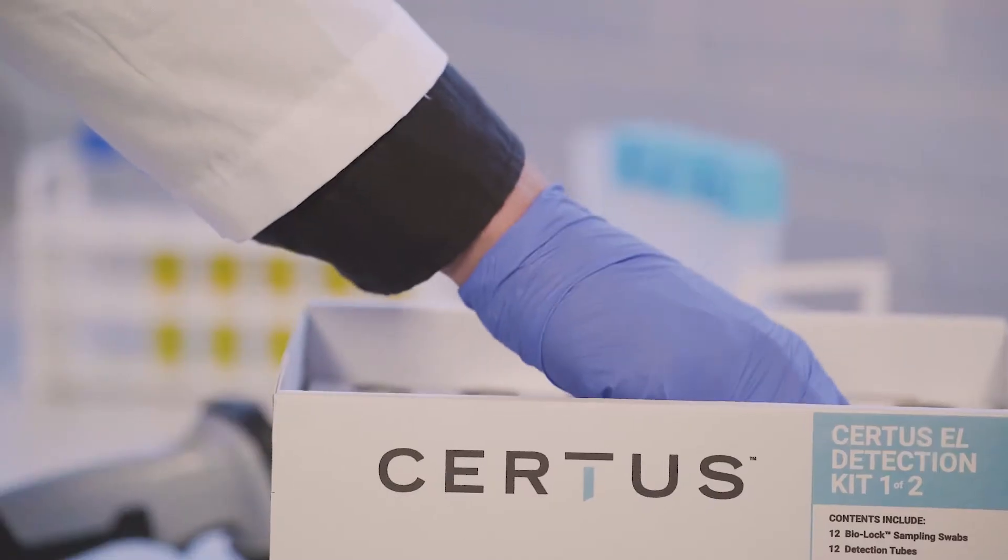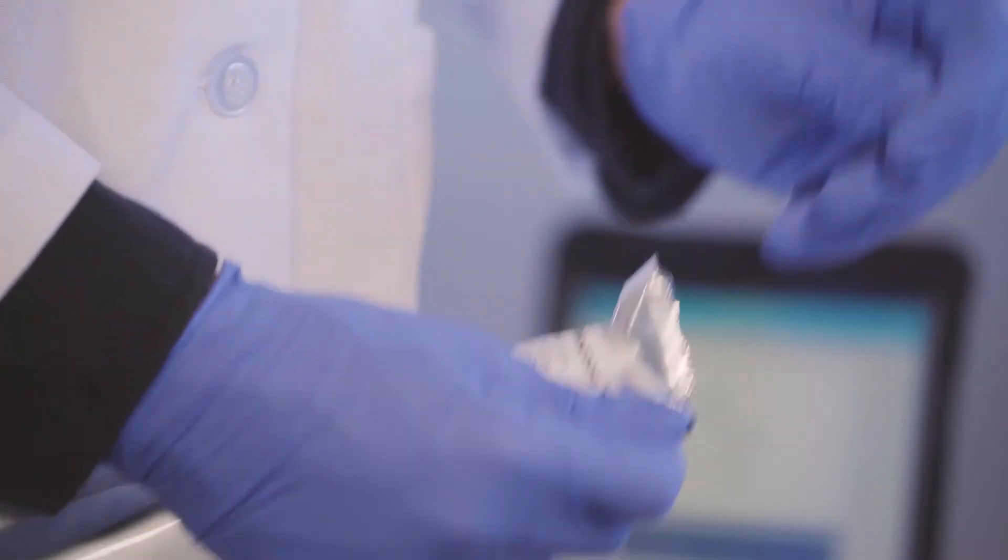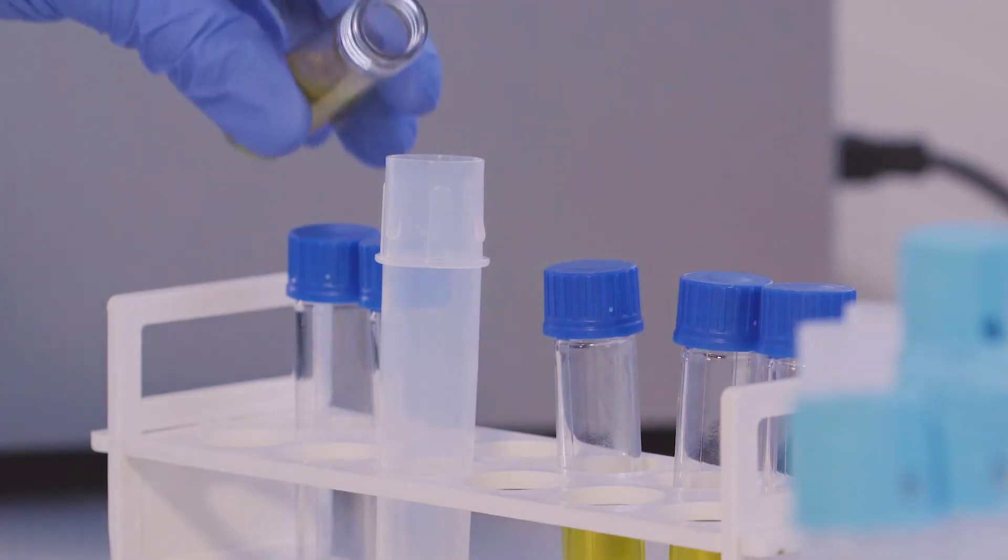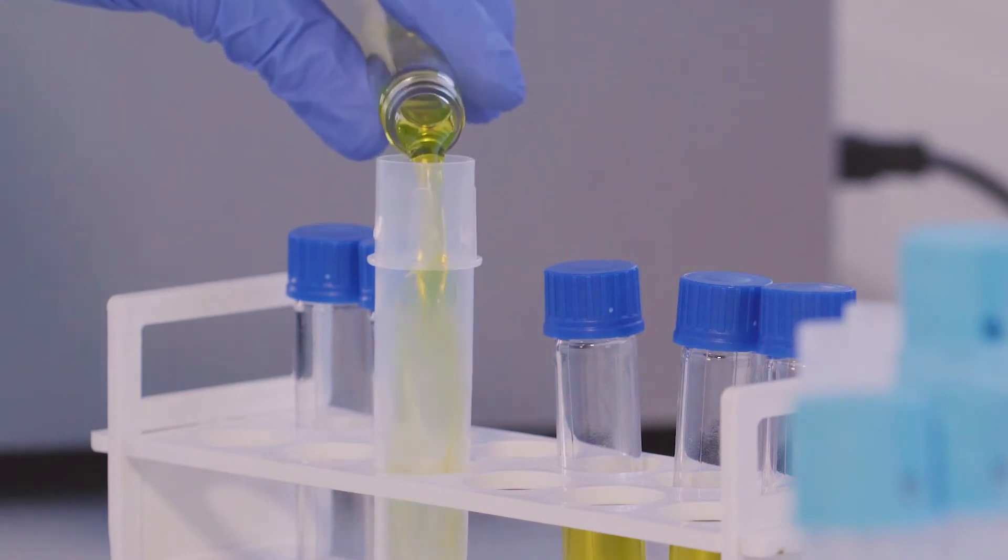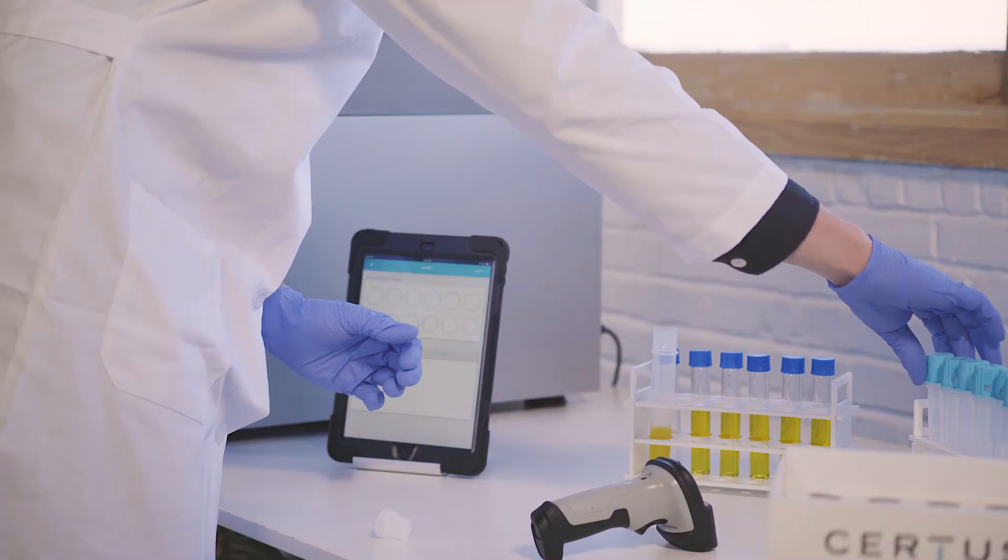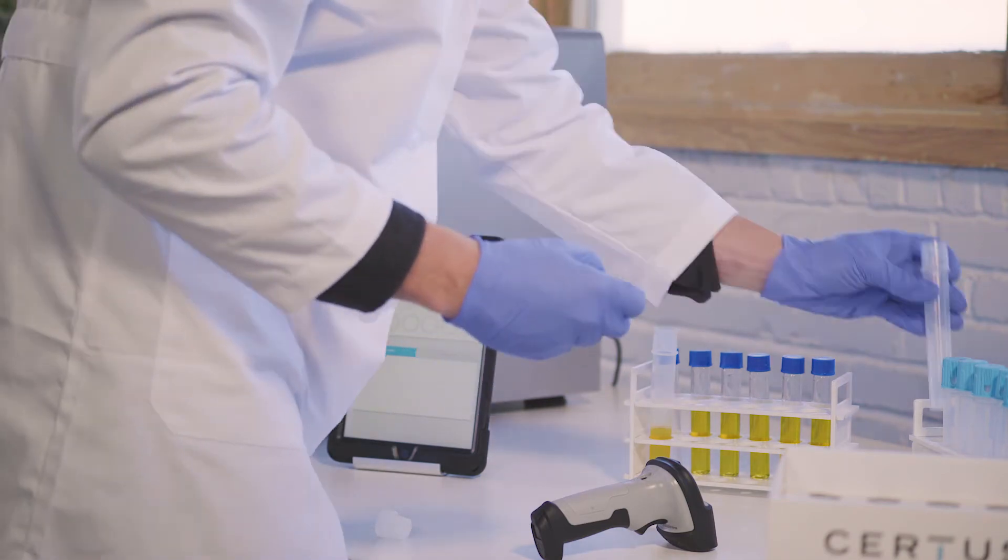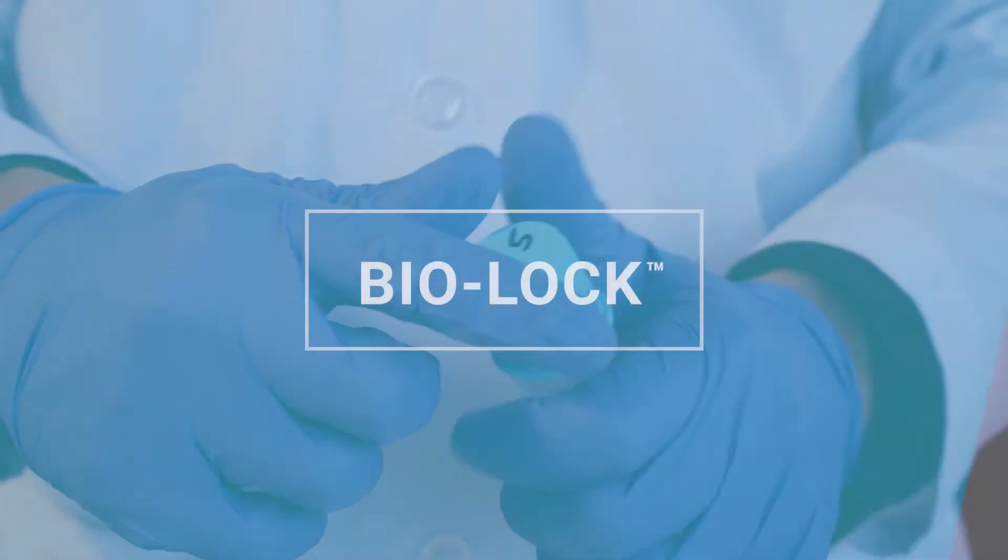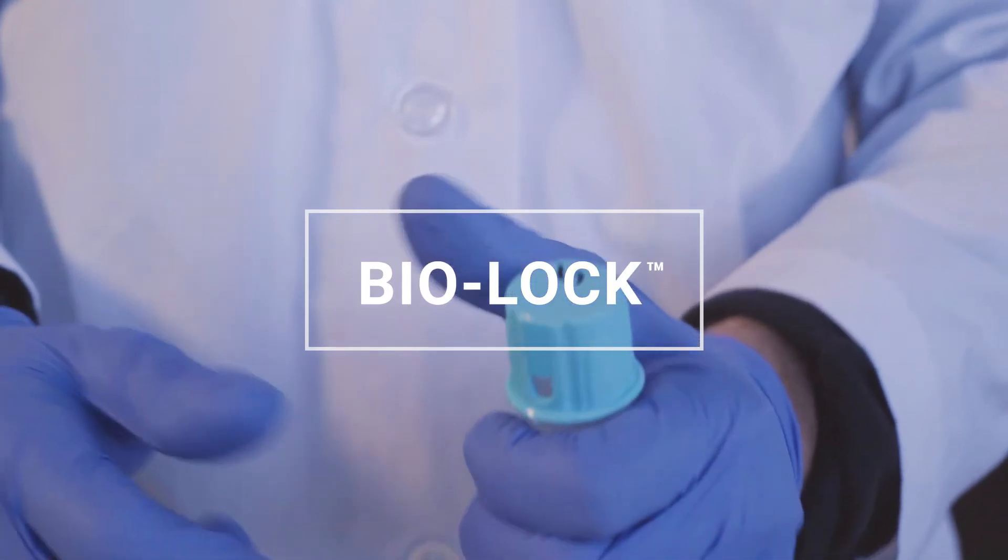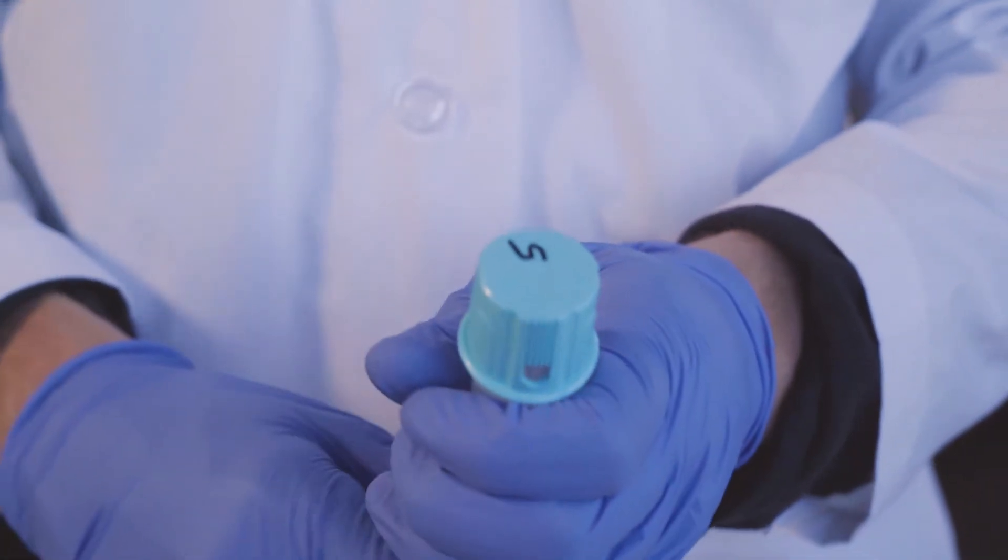After sampling, go to the detection unit, open the protective foil pouch detection tube, and simply add the pre-measured selective growth media. Remove the sampling swab from the transport tube and place it into the detection tube with the media. Firmly press down the BioLock cap till you hear a click. The tube is now permanently sealed, leak-proof, and safe.